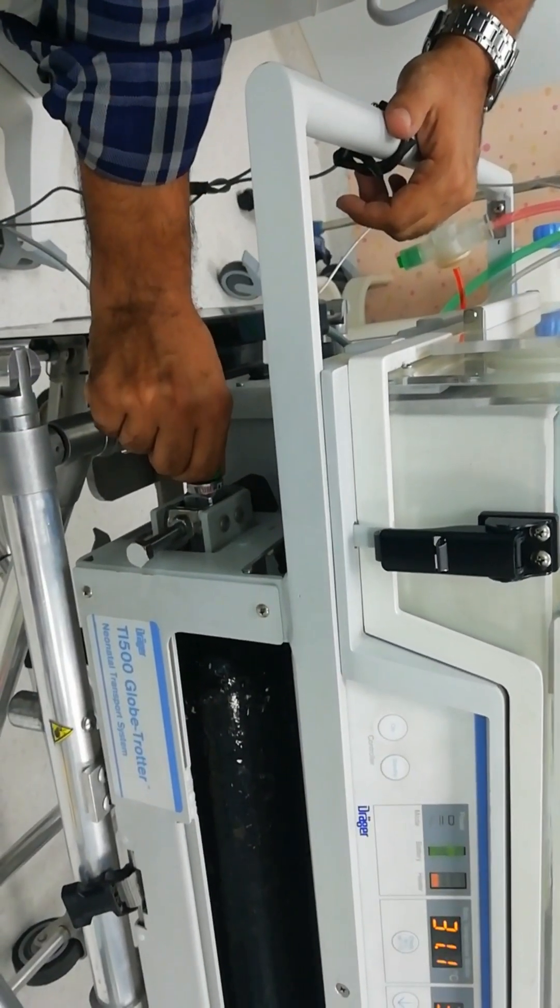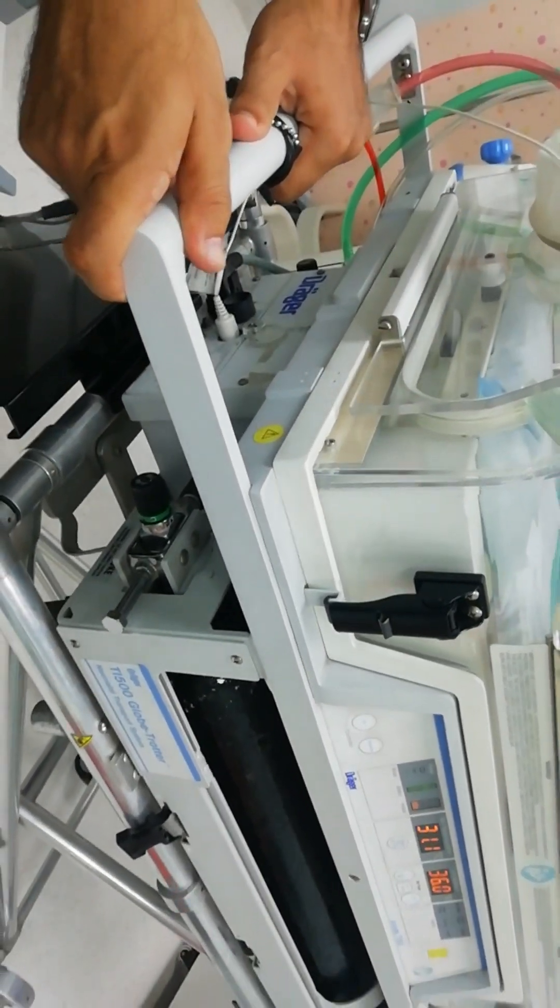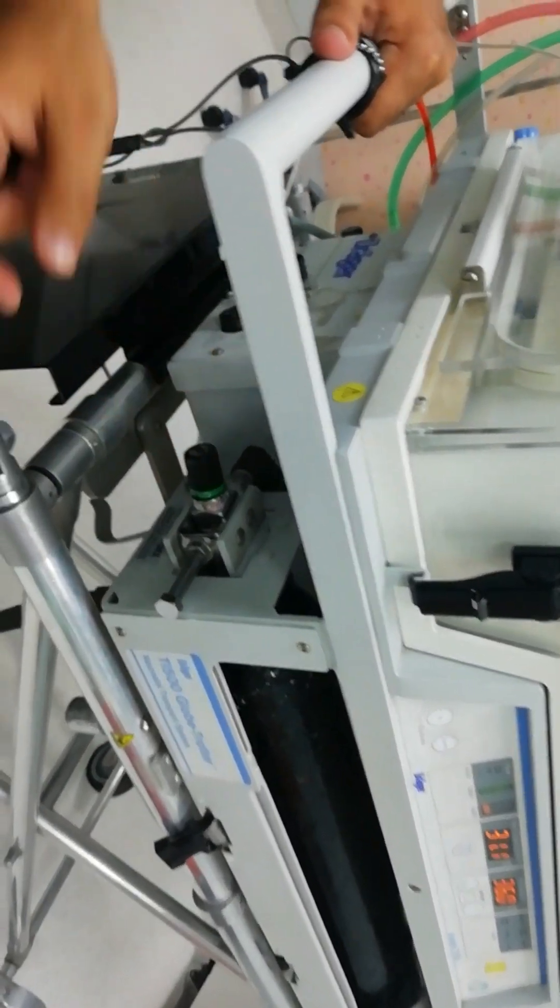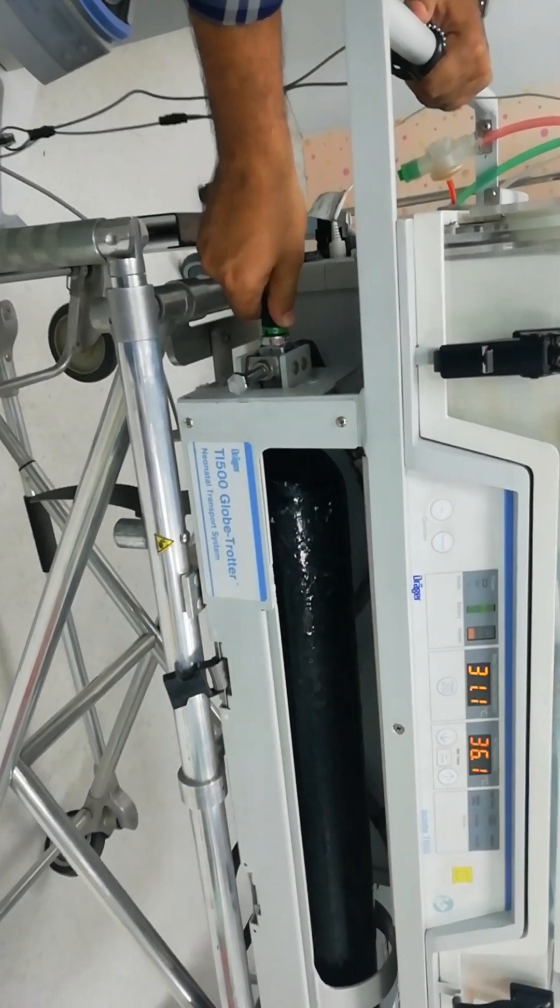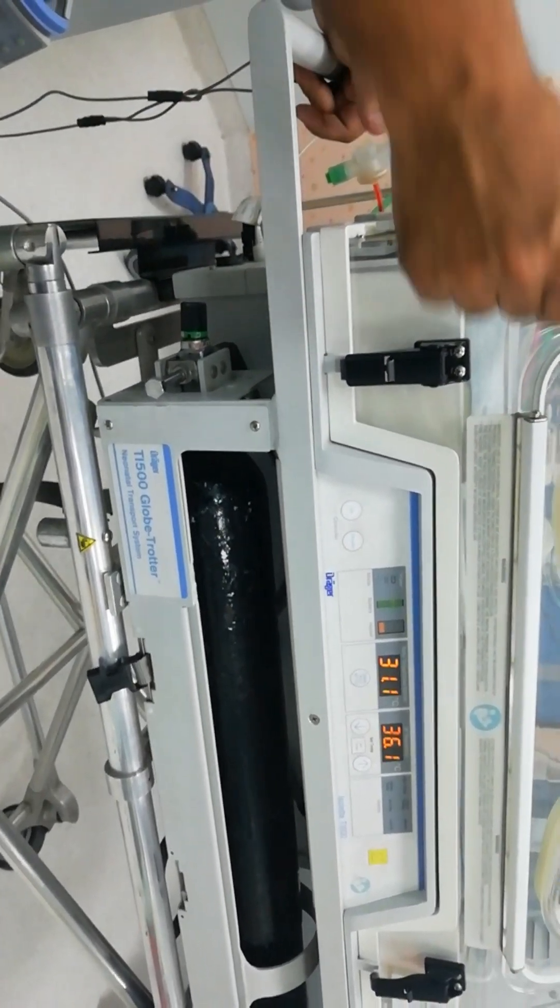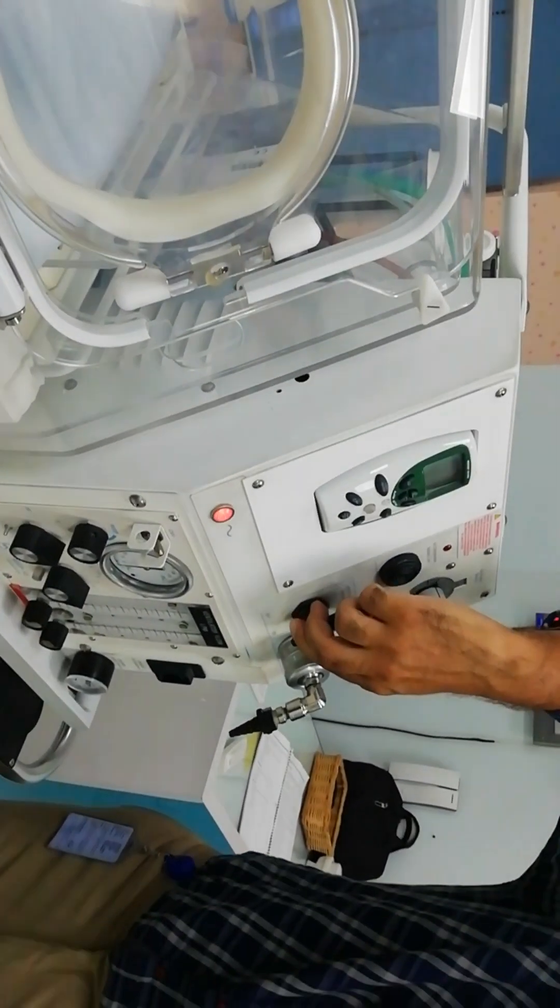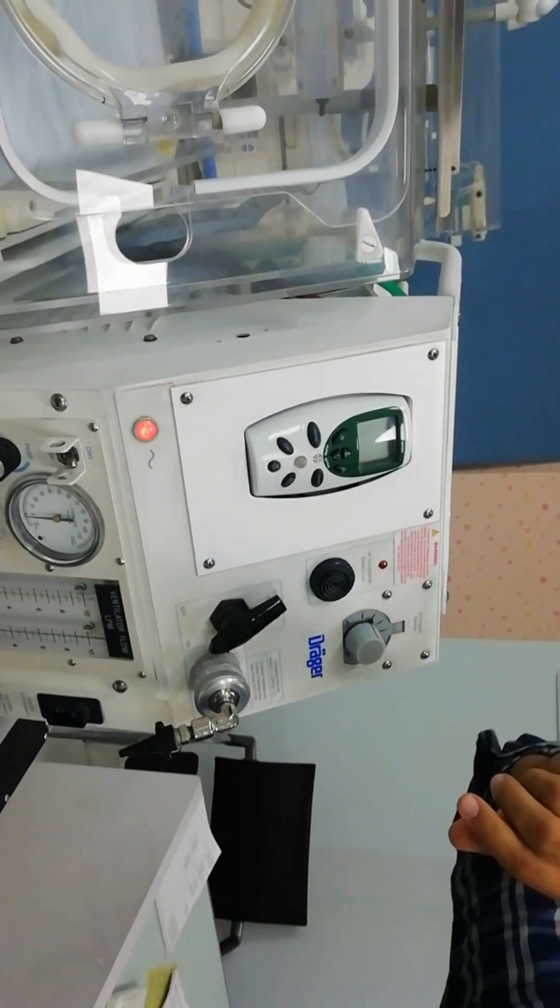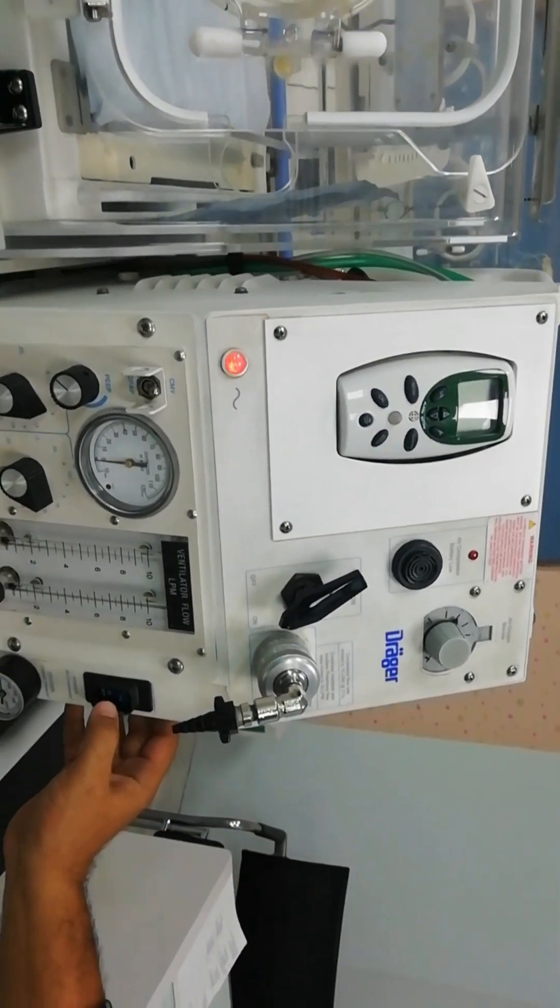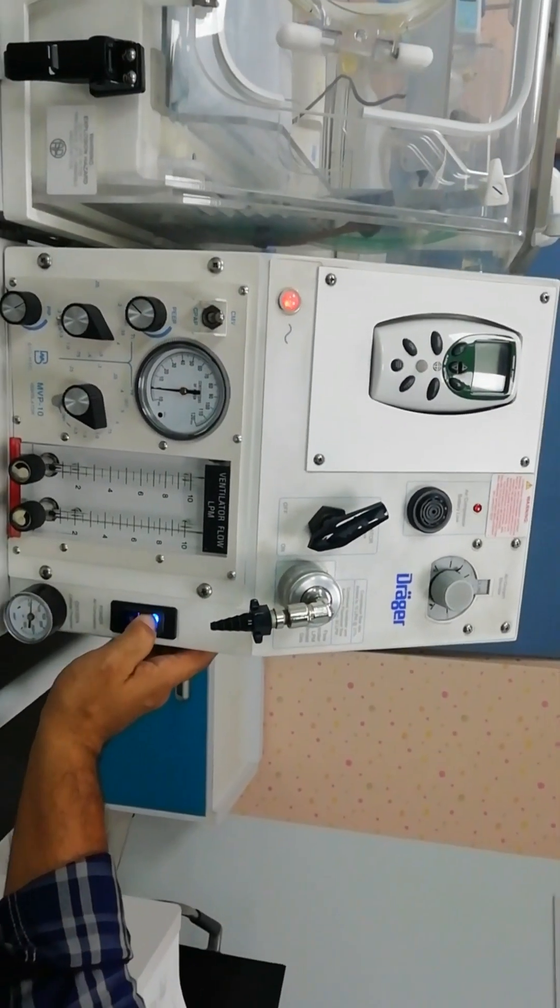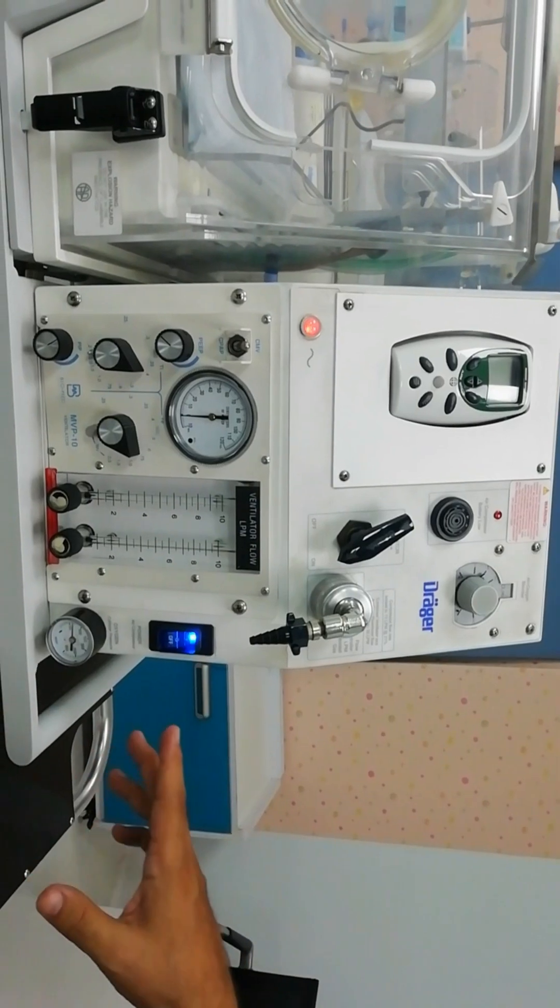We are going to open it. You can see we have to rotate the knob and you have the directions where to open and where to close. Once the gas cylinder is opened we are going to open the ventilator source by turning this knob to on-site, and then we are going to switch on the air compressor. The air compressor as described before would provide us with medical grade air.